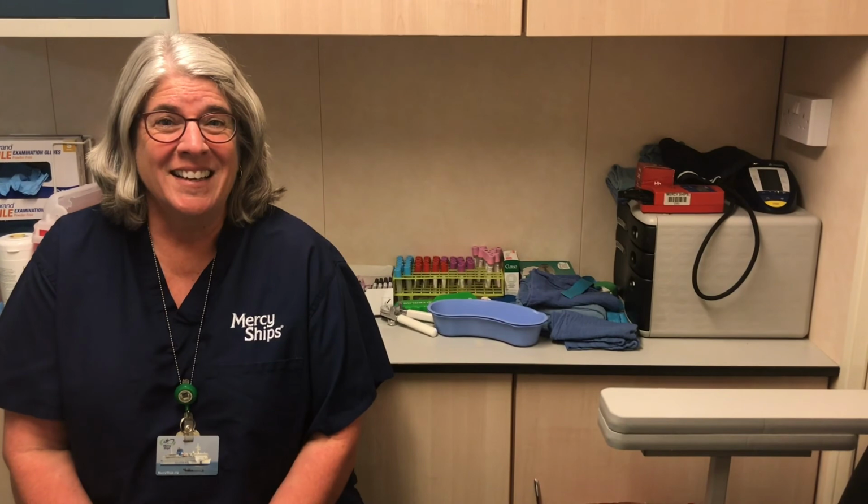We're a walking blood bank on the Mercy Ship. That means all the crew are our blood donors. So the blood we give people is walking around in the body of our donors. We don't store a lot of blood. We might store a few units just for extreme emergencies. Otherwise, we have the crew sign up to be blood donors, and then we'll take your blood and type you and screen you and cross-match with the patients, and then we say, hey, Carys, we need your blood tomorrow. And we might call you up at 2 o'clock, wherever you are, and ask you to come down to the lab and give your blood, and it's awesome.